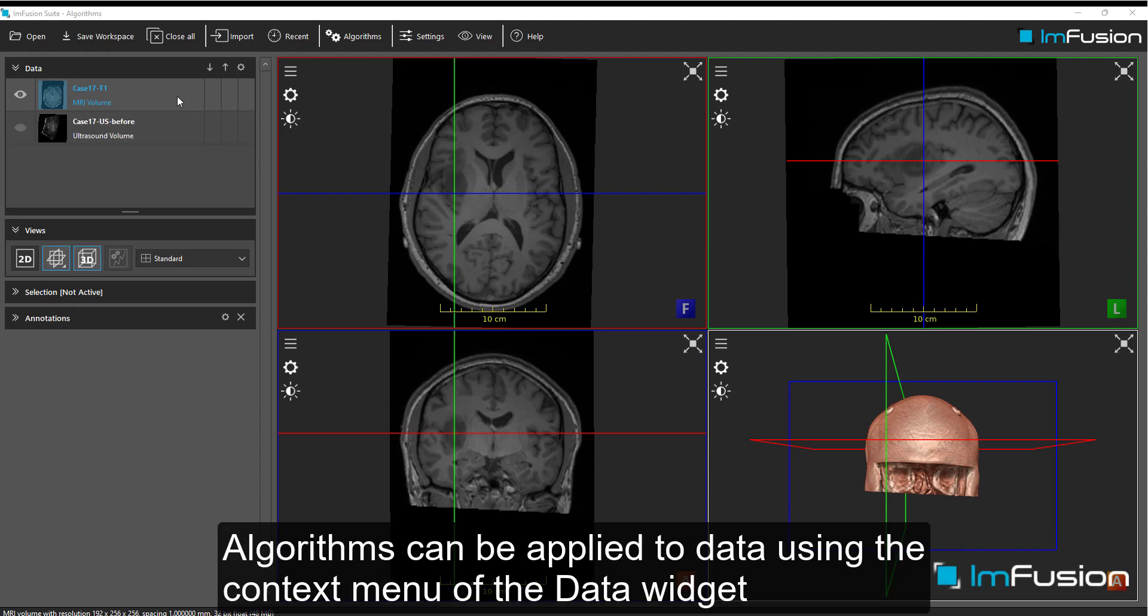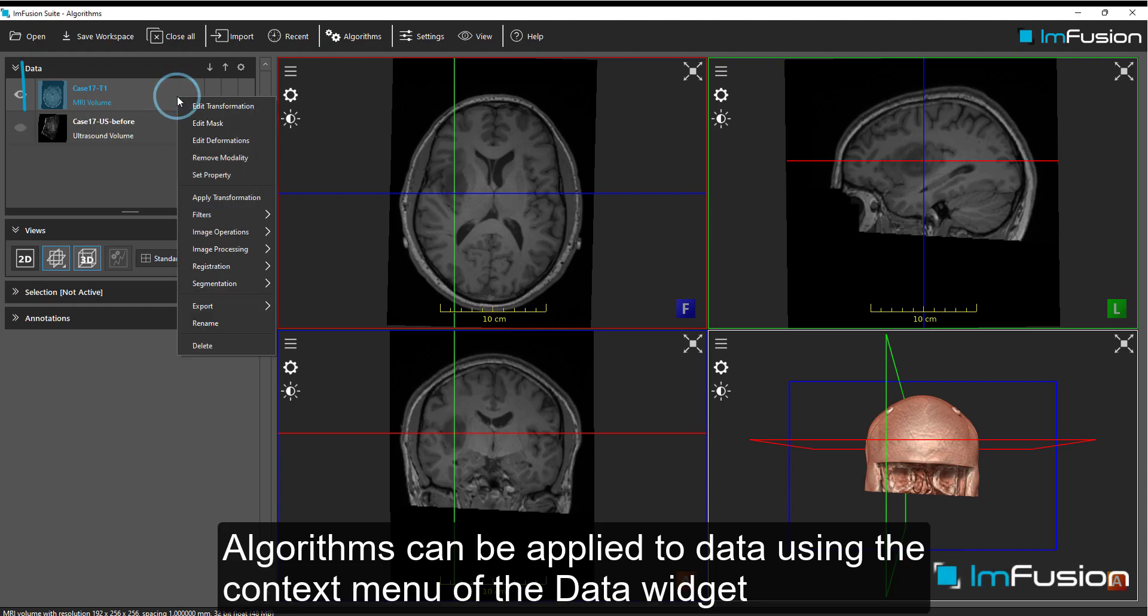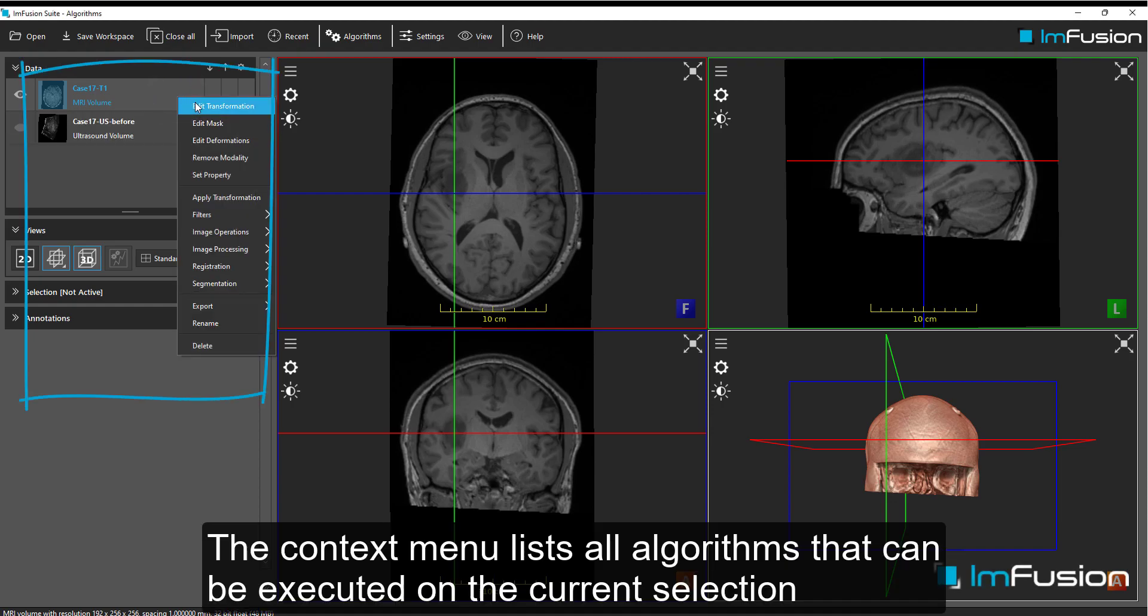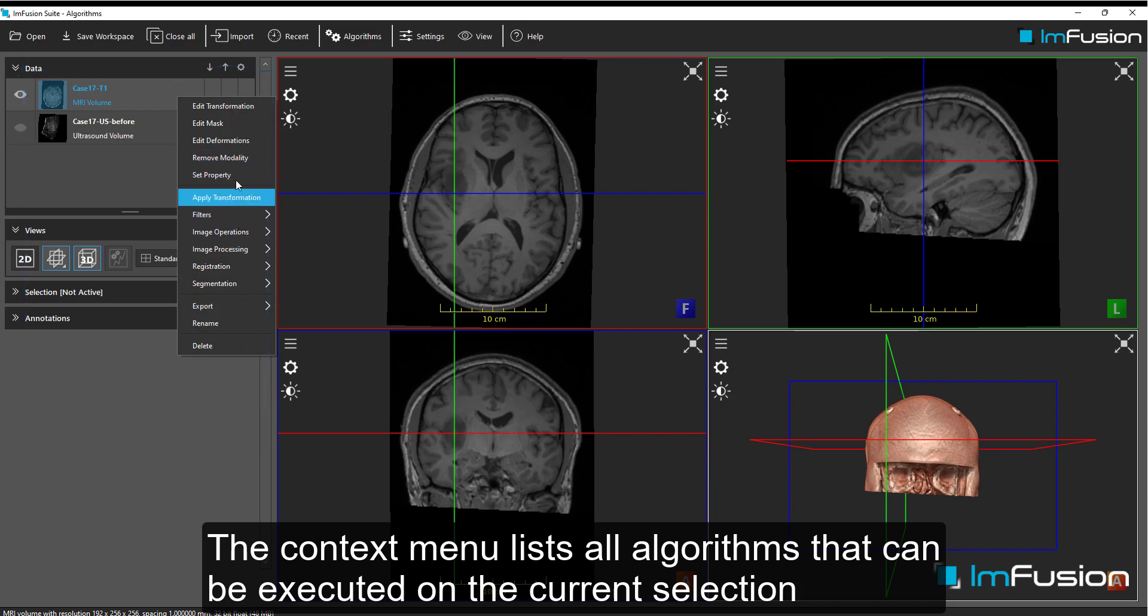Algorithms can be applied to data using the context menu of the data widget. The context menu lists all algorithms that can be executed on the current selection.